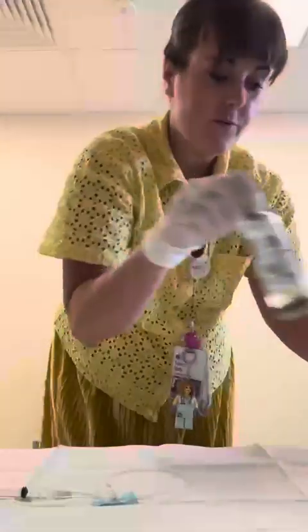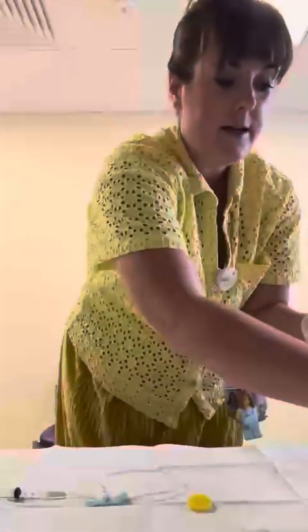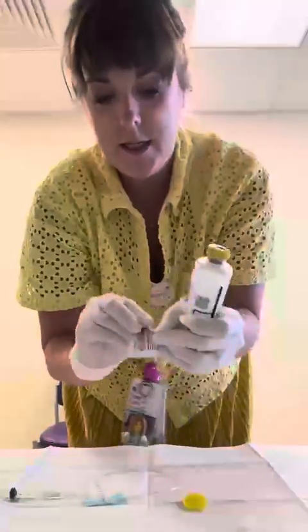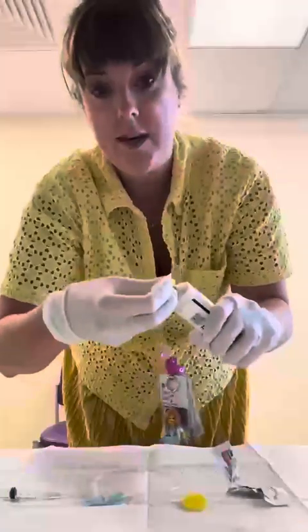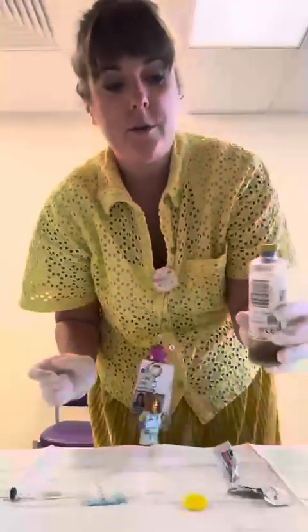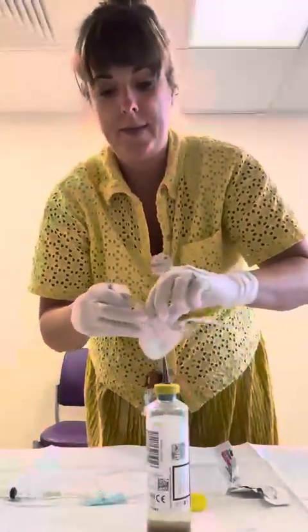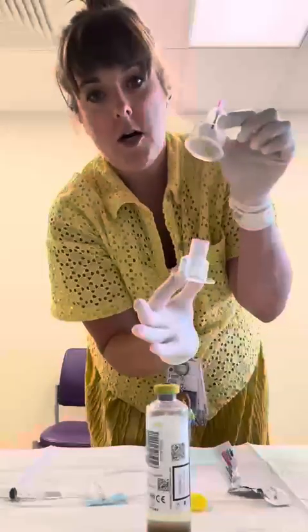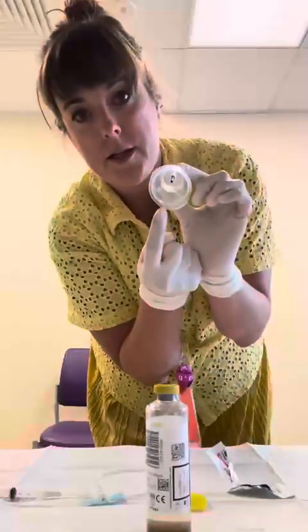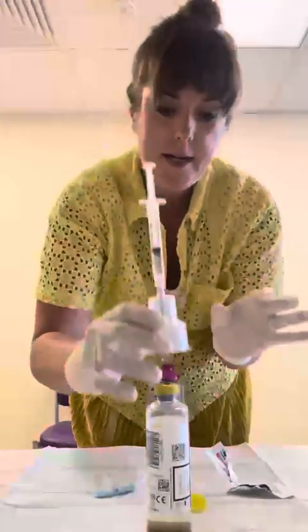The next part is very, very important. You have to flip the lid and then vigorously clean this rubber stopper with an alcohol pad. And let it dry, just like you did with the baby, before you stick the blood sample in. In order to do that, open this up. Take this outer ring off. Careful, because this rubber stopper has a needle here. You're going to attach your sample and then stick it in the culture bottle.